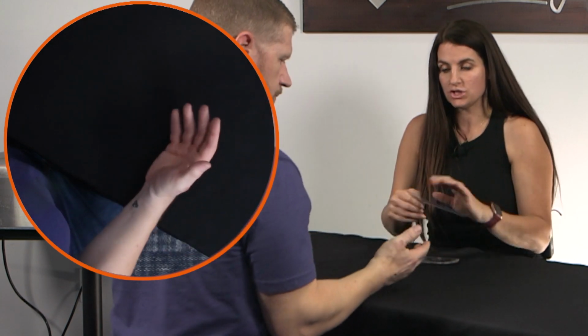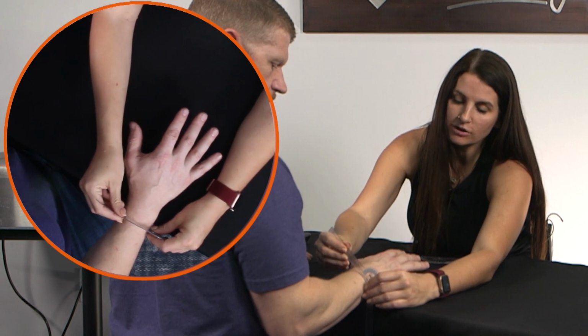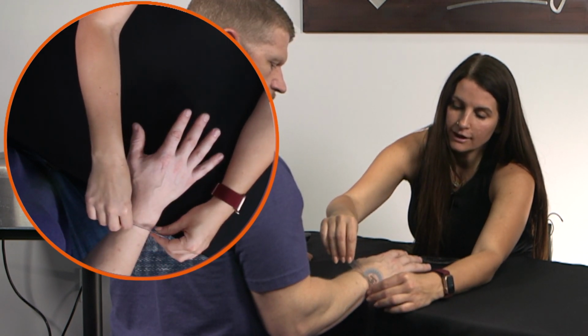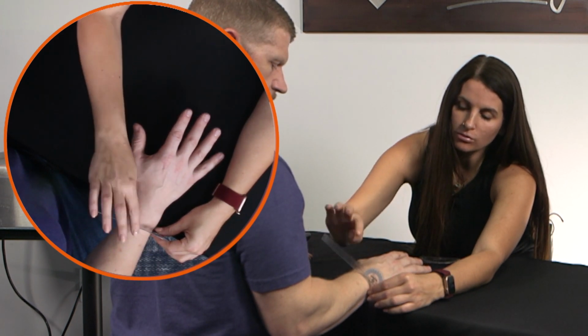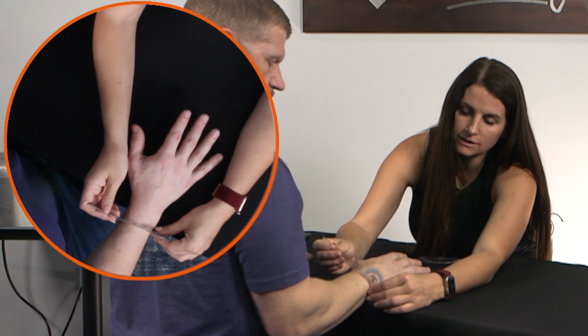And then for pronation, we would go on the ulnar side. You have the stationary arm that is going exactly straight up and down, and then the moving arm that just rests exactly on the arm. And you don't want to push down on this because it changes your results.